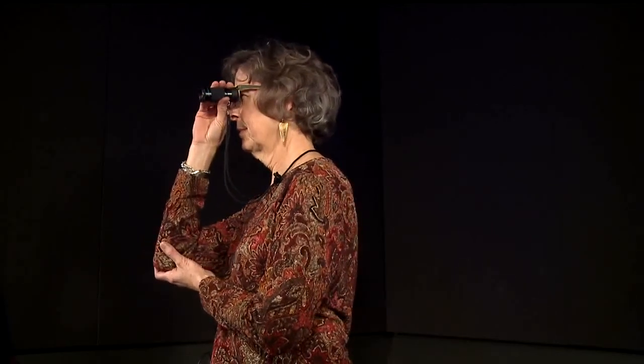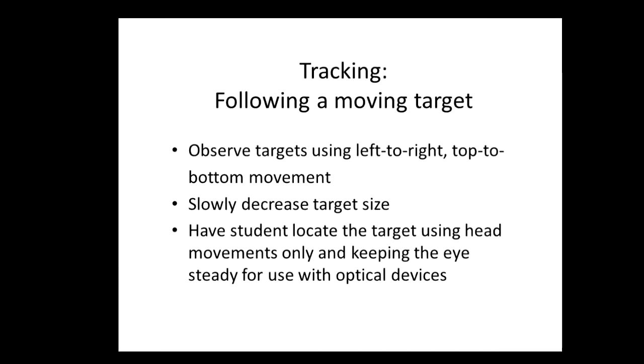Note how I am moving my head with a scope up against my eye rather than moving the scope as I keep my head still. Focusing on objects in the foreground will be easier, but begin to call attention to objects that are further away and thus appear smaller. This requires refocusing and is more difficult. Using a larger landmark is helpful.